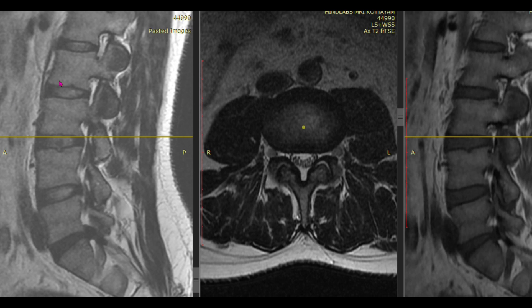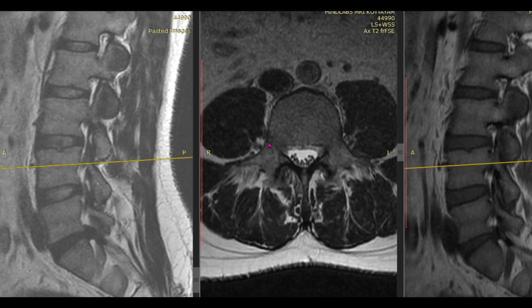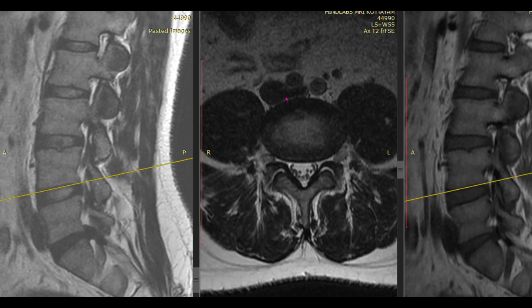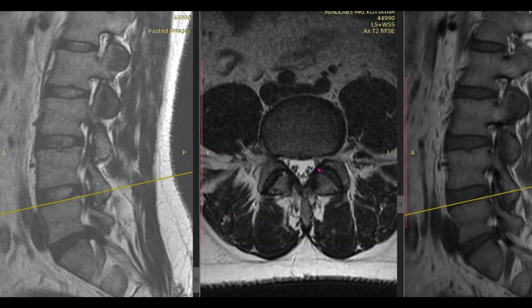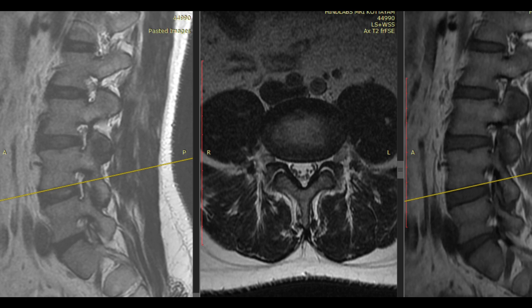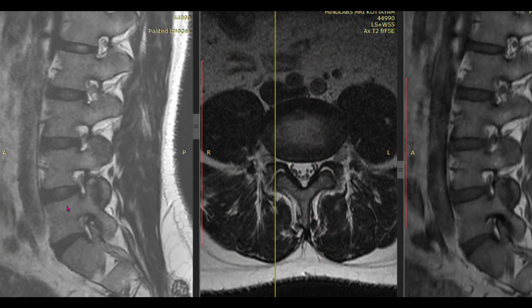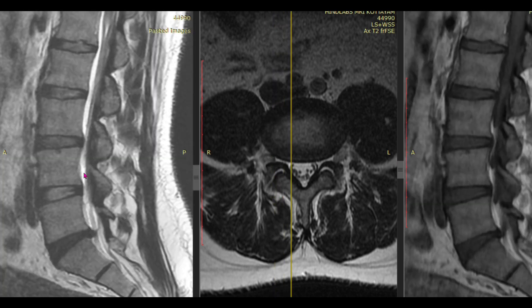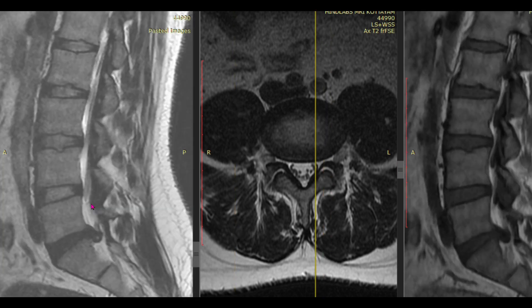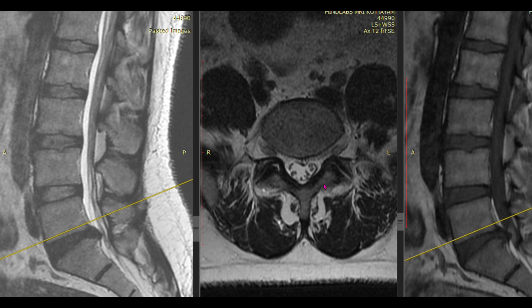At the next level, similarly comparing the vertebral body level above, you can see the disc has lost its posterior concavity and has become convex, almost touching the traversing nerve roots on both sides but not compressing them. In the sagittal sections, there is no significant foraminal narrowing on either side, as both exiting nerve roots look normal and are not being compressed significantly.